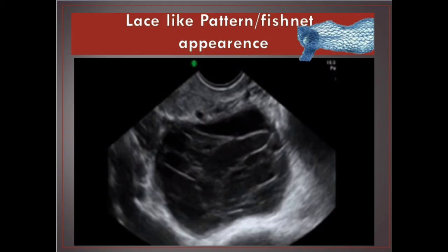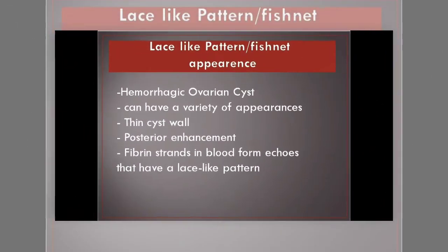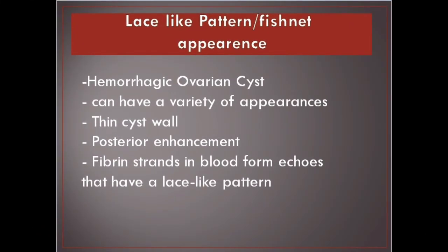Lace-like pattern. Hemorrhagic ovarian cyst can have a variety of appearances: thin cyst wall, posterior enhancement, and fibrin strands and blood form echoes that have a lace-like pattern.